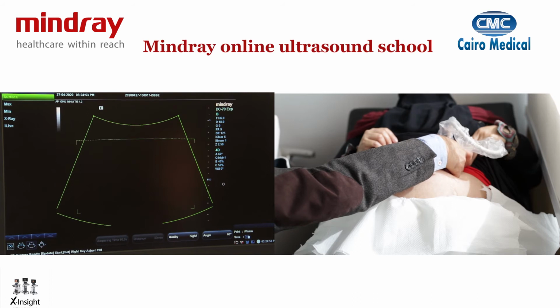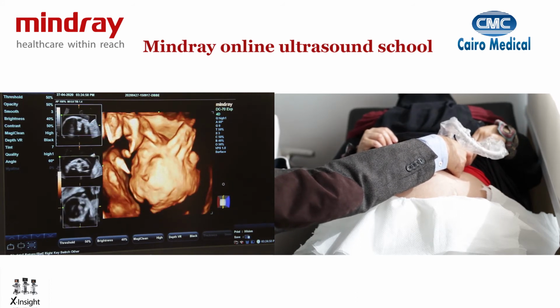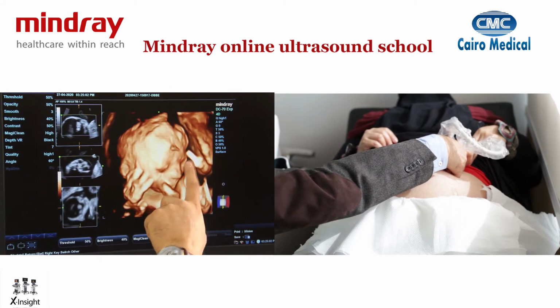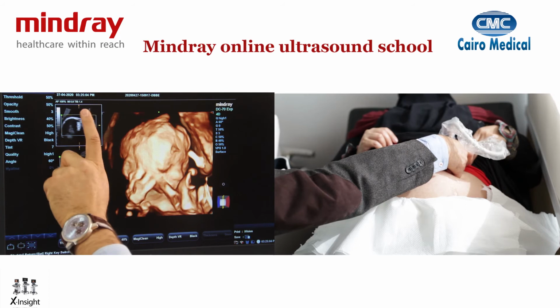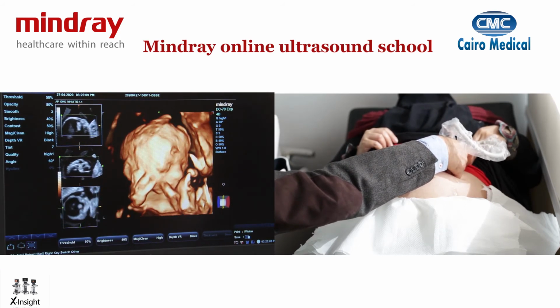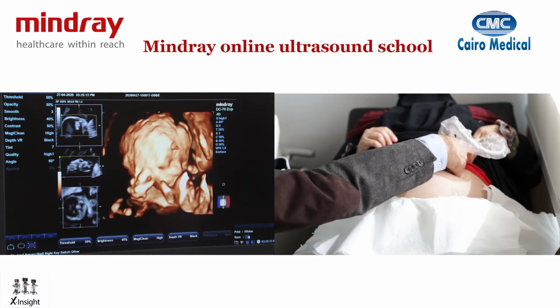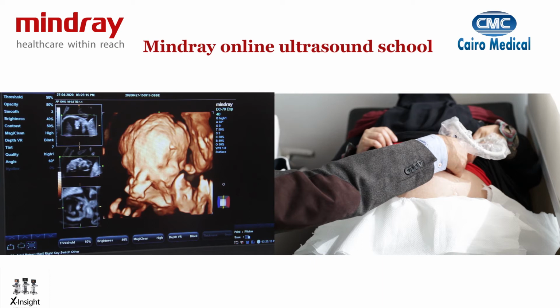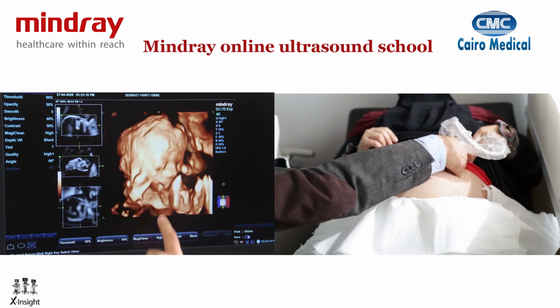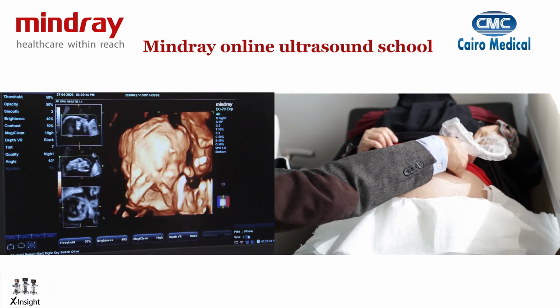And if I update the image, I'm going to flip it because the baby's facing downwards. You can see here the nose, the mouth, the eyes. What I can do is take the reference image, which is this one here, and you can actually move close to it because you can see there is a limb in front of the baby's face. So I'm going to move my 4D image while my scanning hand is fixed, so I can actually get a bit closer to the face. I can see the eyes, I can see the nose, the mouth, the chin.